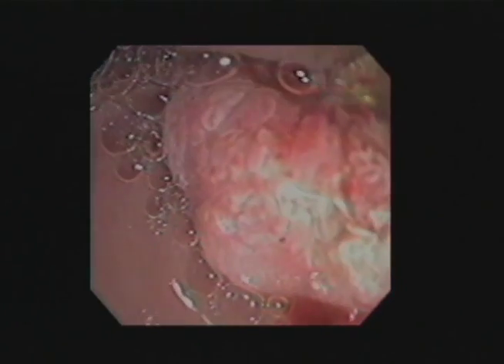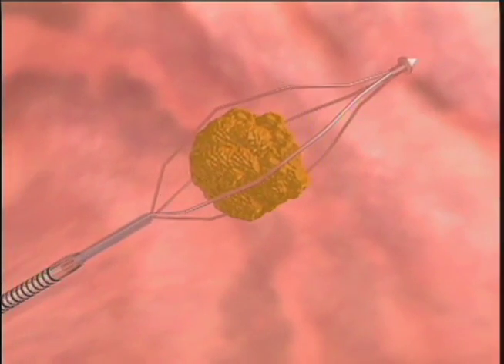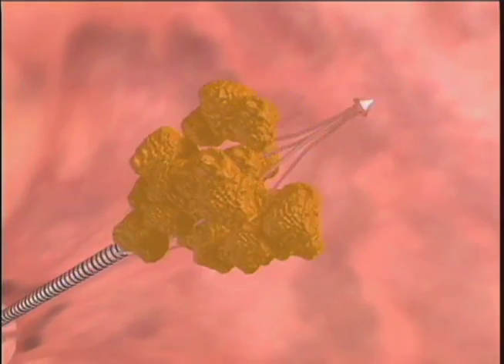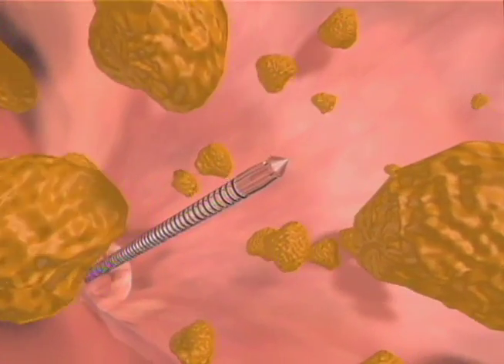The Olympus Mechanical Lithotriptors, models BML 3Q and 4Q, have been designed for endoscopic crushing of biliary calculi and facilitate easy insertion with superb grasping capabilities.